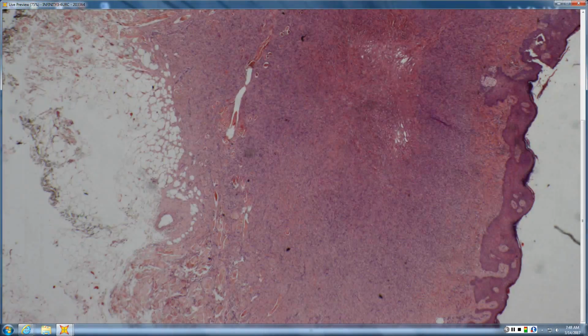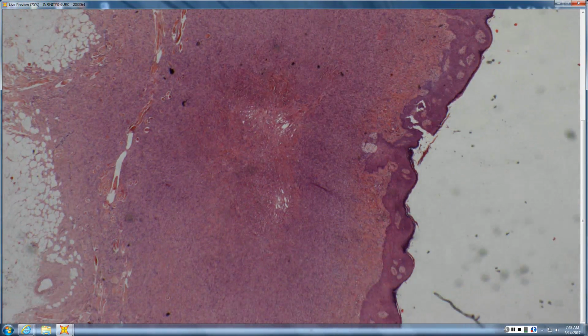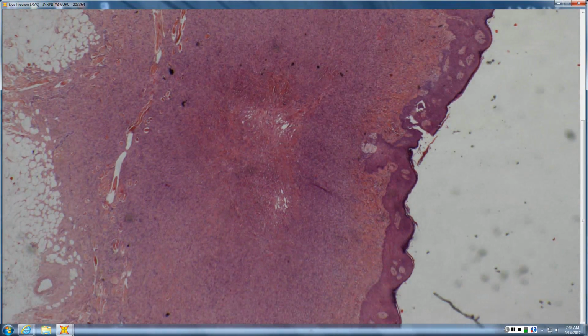Like the juvenile myofibromas? Myofibromas are not. You're commenting because the blue in a myofibroma looks a little similar. It's not really mucin, it's collagen that gets that hue. But the myofibromas are not grouped with the myoepitheliomas. Okay.